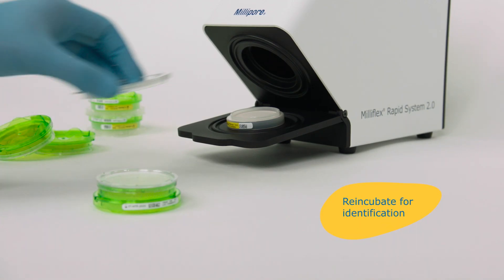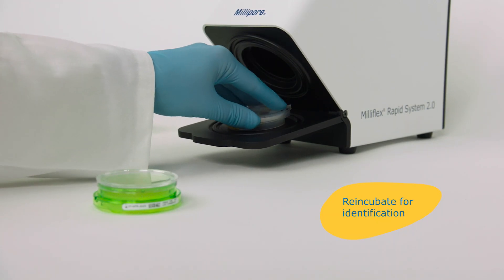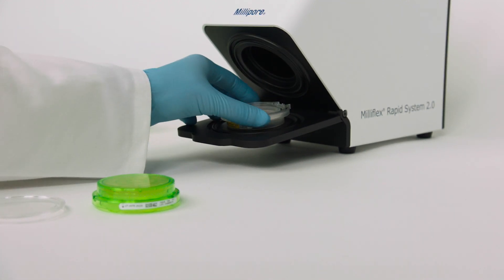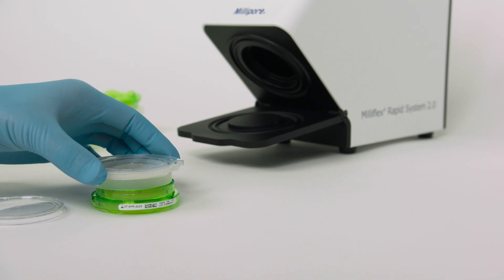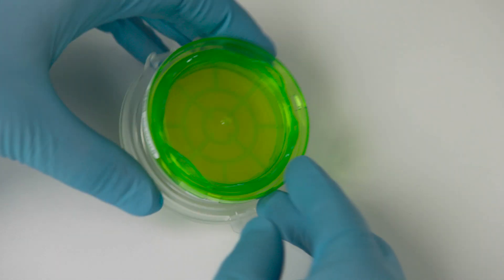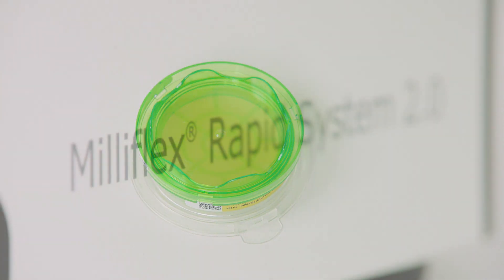If microbial contaminants are detected, the Milliflex Rapid System 2.0 method gives the option to identify these later on by any usual method. Simply place the membrane filter onto a fresh agar plate and re-incubate to grow visible colonies.